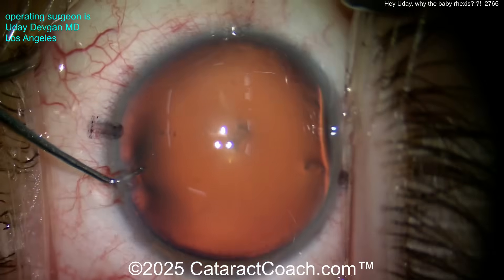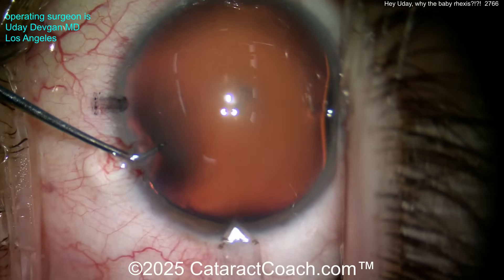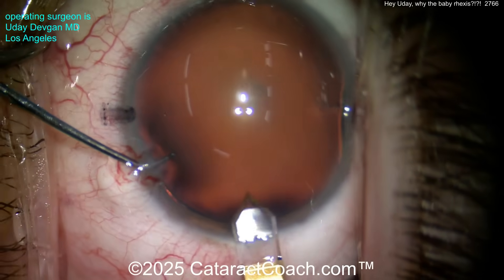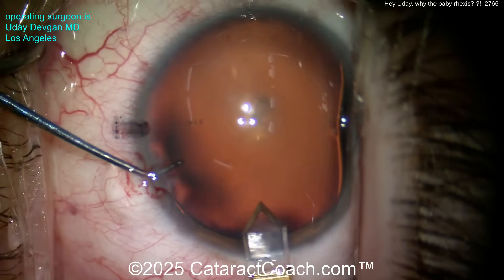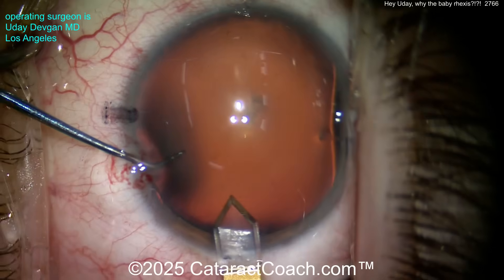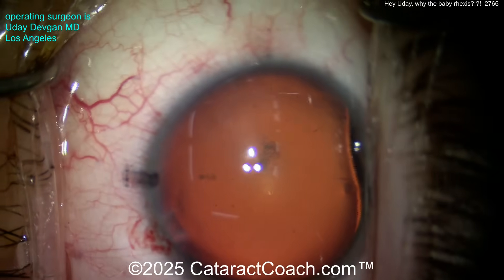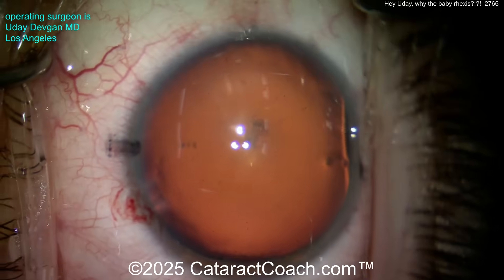You can't just say okay, let me wing it and do a rhexis the way I feel. No — you've got to measure it. Despite this patient having a very large corneal diameter and a very large anterior segment, look how tiny the incision looks. It's a normal incision, same keratome we always use. The catch is this is a very large myopic eye.